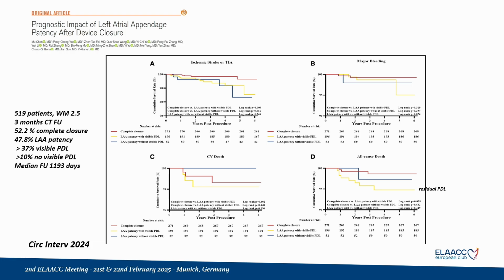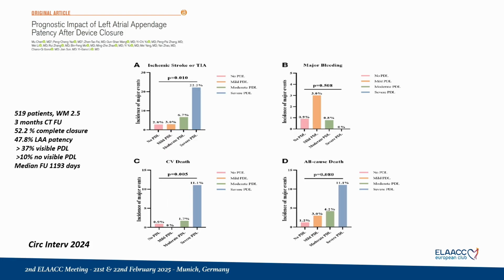And if you look, they've even differentiated patency with or without visible PDL. And both of them are associated with a higher rate of ischemic stroke. And even a residual PDL on CT has a prognostic impact on all-cause death, which is totally new for me. And they've used the same cutoff as TE, and I disagree with that.